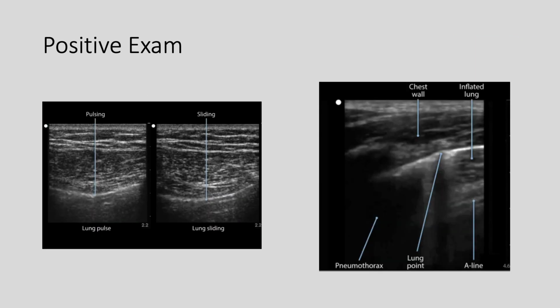If the sliding lung sign is absent, move the transducer in a posterior lateral direction along the same rib space and attempt to identify a sliding lung sign. The absence of a sliding lung sign supports the presence of a pneumothorax. Again, this is not necessary if lung sliding is initially seen at the location scanned, such as the anterior chest. Trace the relative size and margins of a pneumothorax by identifying the locations at which the sliding lung sign is present and the sites at which it is absent.